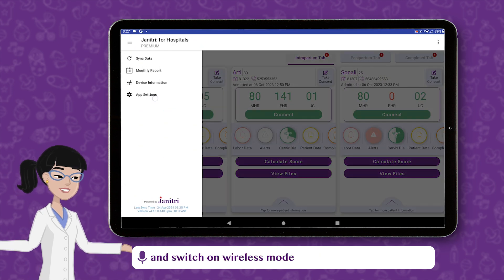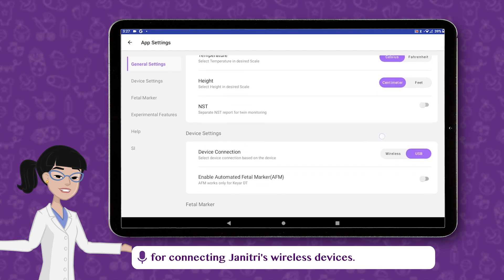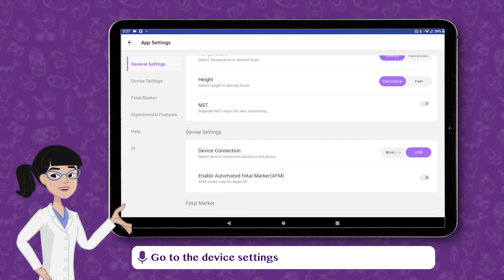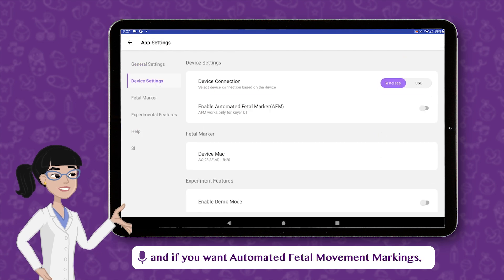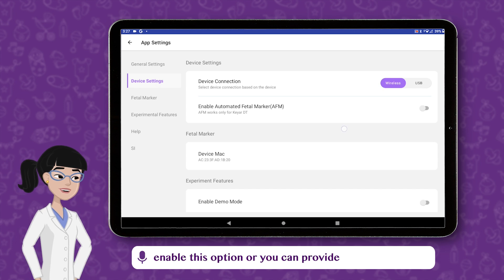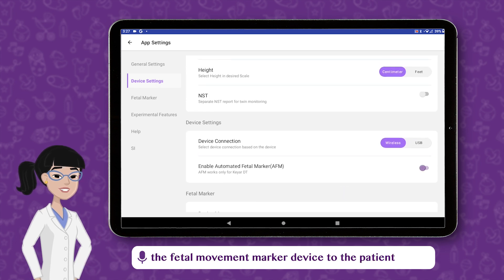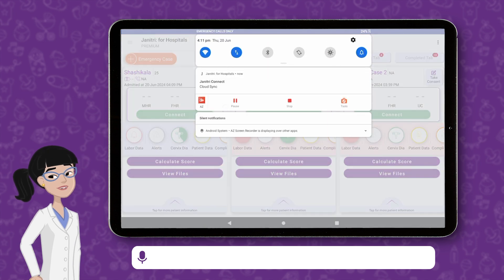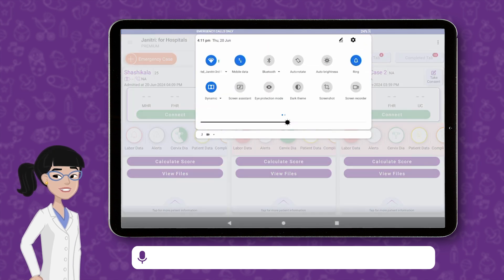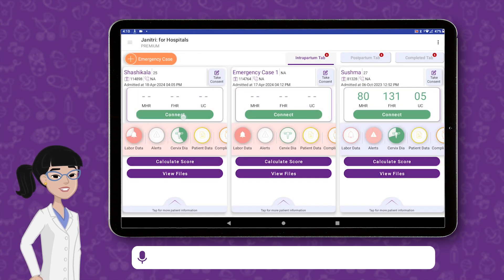Go to App Settings and switch on Wireless mode for connecting Janitri's wireless devices. Go to the Device Settings and if you want automated fetal movement markings, enable this option, or you can provide the fetal movement marker device to the patient to monitor movement manually.